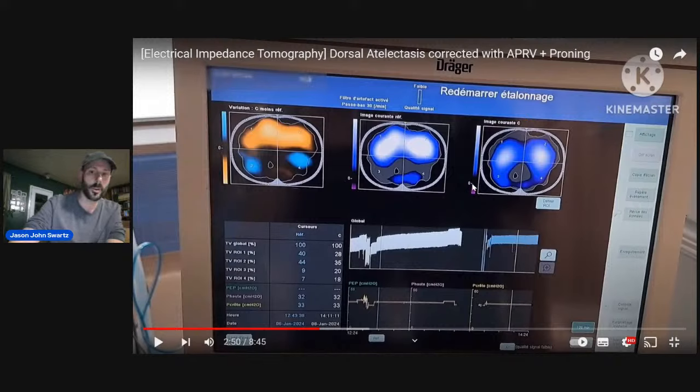So we turned the patient over into the prone position to make this area the gravity dependent region in the prone position. This helped protect the more compliant, healthy lung area by having the patient's body weight kind of like splinting, and then after liberating the body pressure from the dorsal area, right away we see that it's starting to open up.